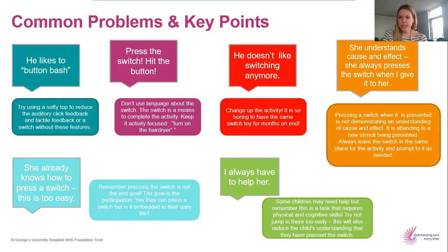He doesn't like switching anymore. So again, that's thinking about the activity. Switching isn't an activity. We need to change up the activity if someone's not liking that. So if someone has used the same switch toy for ages and ages, then they probably are going to find that a bit boring. So it's looking at what activities we're offering with switching.